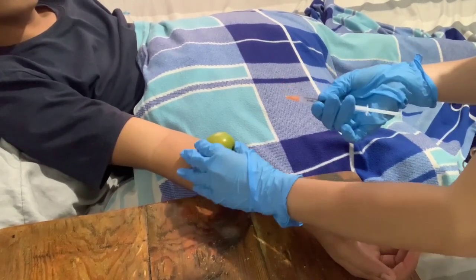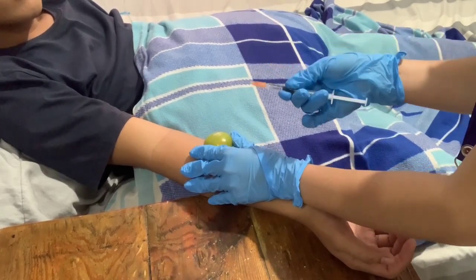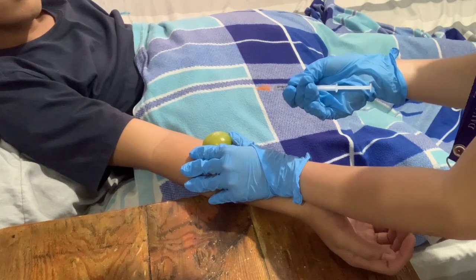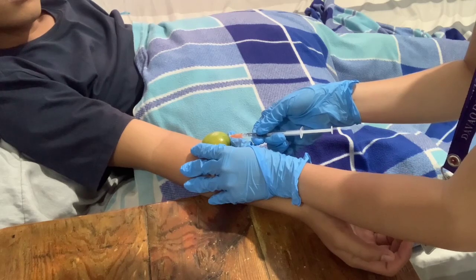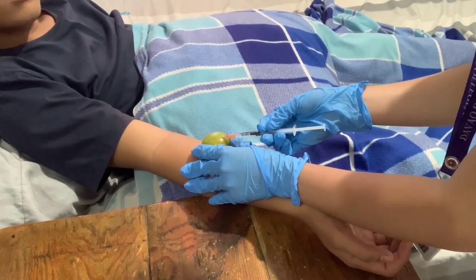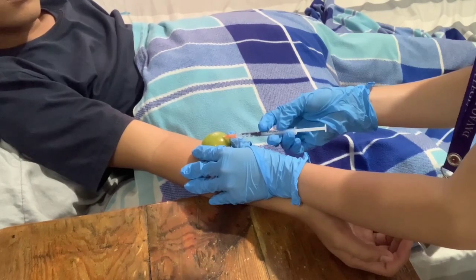So now we are going to inject the fluid or the medication into the skin. So with our non-dominant hand, this one, my left hand, we are going to pull the skin at the site until it is taut. Okay, so now I'm going to insert the tip of the needle far enough to place the bevel through the epidermis into the dermis. So that is a 10 to 15 degree angle. So now I'm going to stabilize the syringe and the needle. So now we are going to inject the medication carefully and slowly so that it produces a small wheal on the skin.